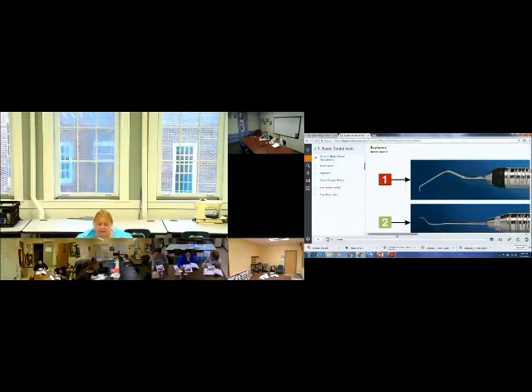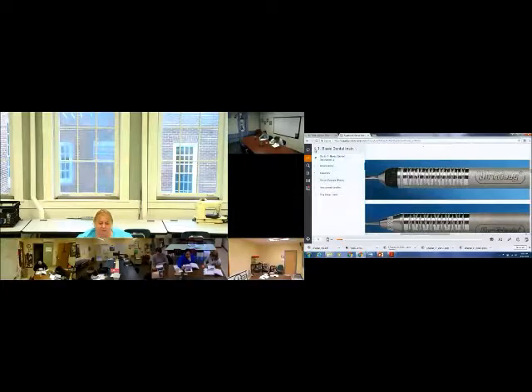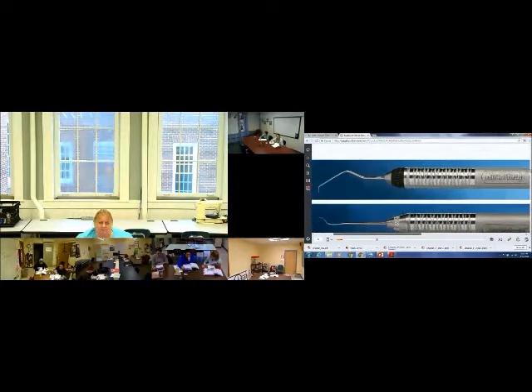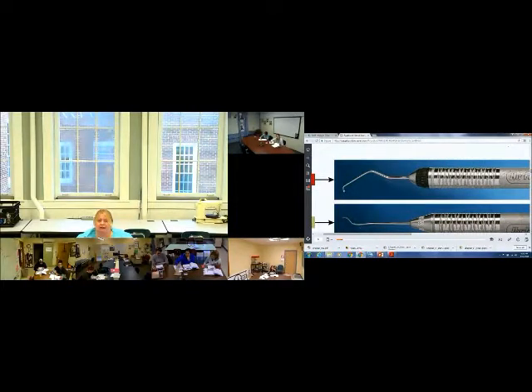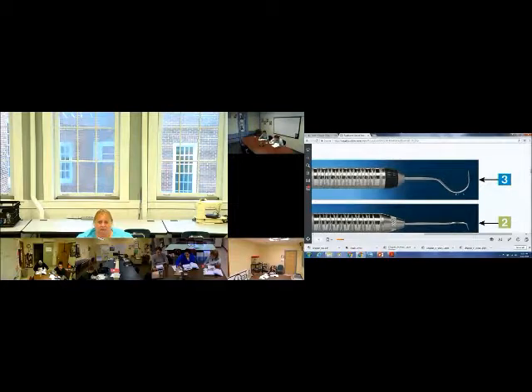Our next instrument is the Dental Explorer, and the most common is pictured in the top row here. So this side is called the Right Angle Explorer. It's mostly called the Right Angle Explorer. And then this side is the shepherd's hook. They are typically combined on one instrument so that we can do most of the checking and examination.